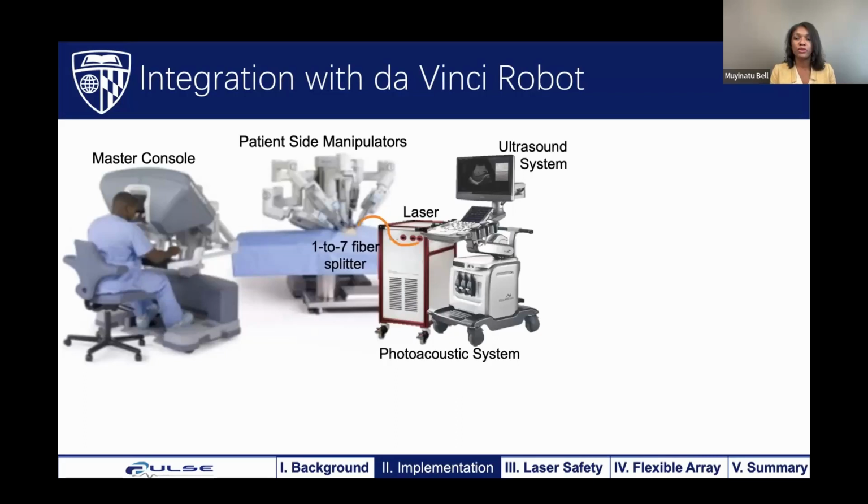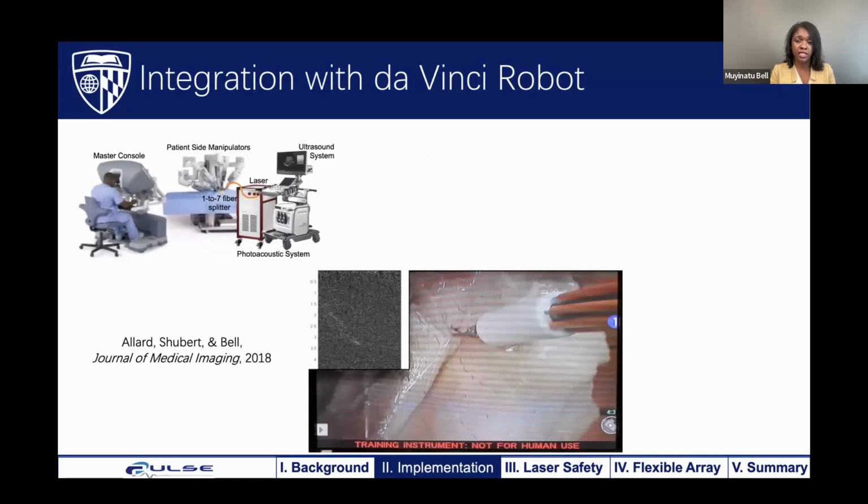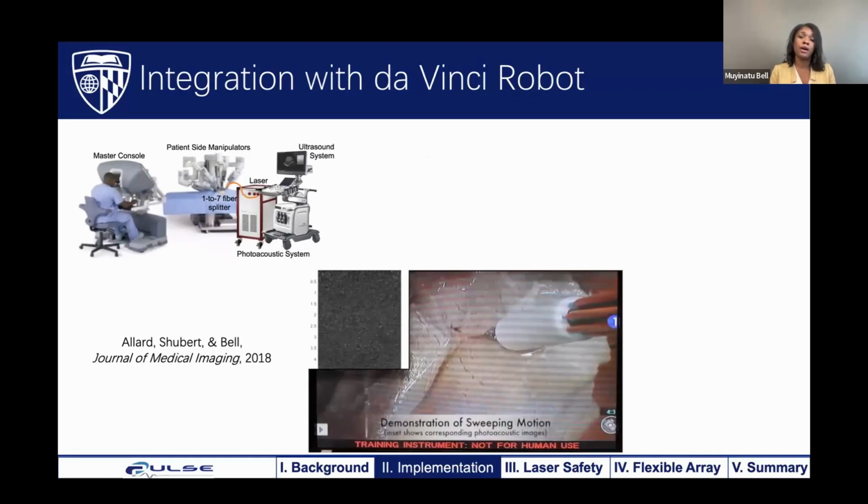Our goal with a photoacoustic approach is to bring in the photoacoustic system and attach our specialized light delivery systems to the surgical tools to enable the additional visualization of structures that are hidden. So we now transition to a view of what the surgeon would see when looking through the master console and navigating this tooltip around the area of interest to determine where to make an incision. The inset shows a photoacoustic image video that could be displayed through that master console.